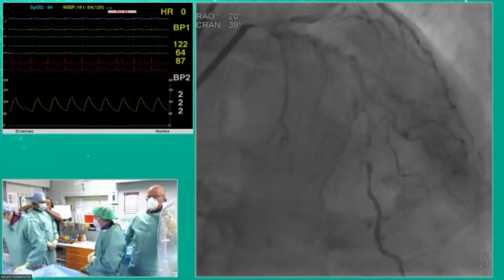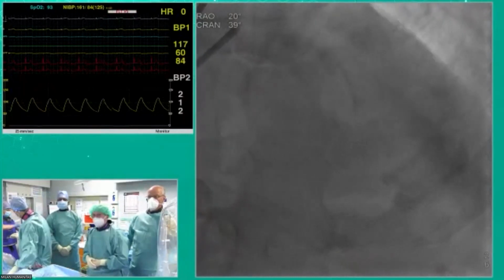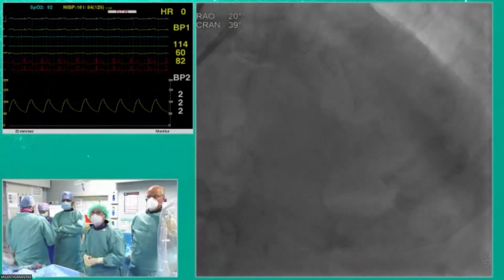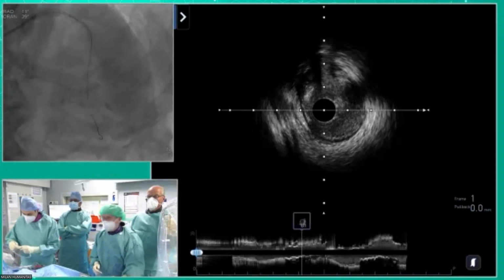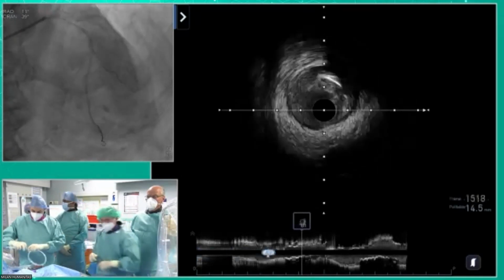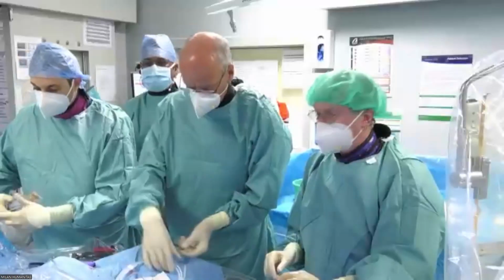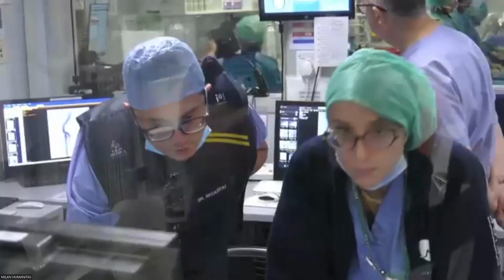Sarab, you were going to ask the question, any data using the IVUS after the prep step versus otherwise? I don't know of any data specifically, but I actually think in a stenting case, it's probably more important to IVUS before you put the stent in than before you do anything to the lesion itself. If you're going to use this approach, I think it's fine either way, but this was helpful for sizing purposes. I was surprised by the size of the LAD, which I always am. Angiographically, it looks like it's not a substantial vessel, and it almost always is more substantial on imaging than on angiography.